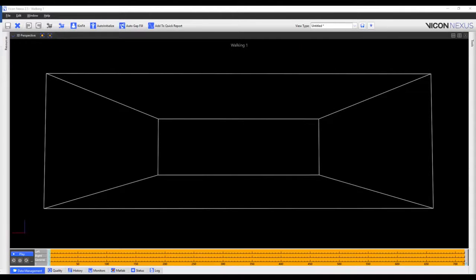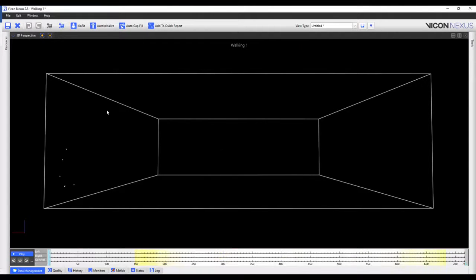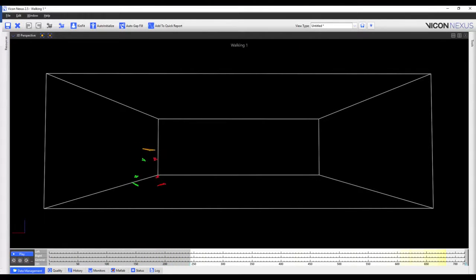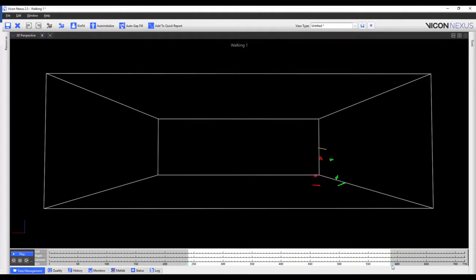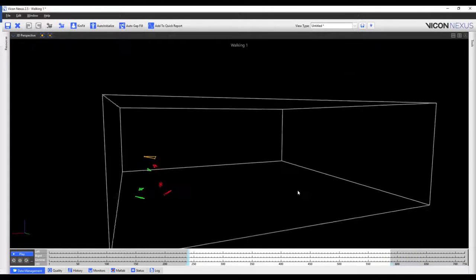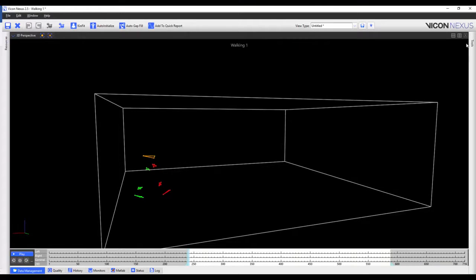I've now loaded another walking trial, and I'm going to reconstruct and label it. I'm also going to crop it to where the subject first enters the capture volume and to where the subject leaves the capture volume. And now I'm going to assess the labeling.